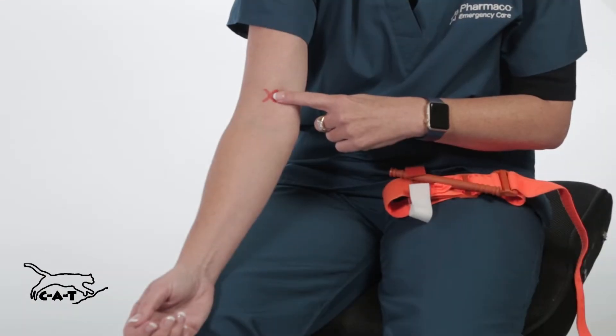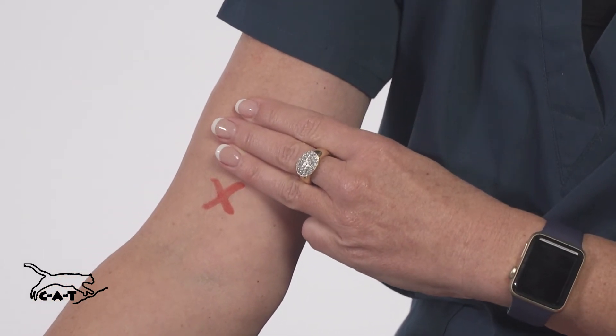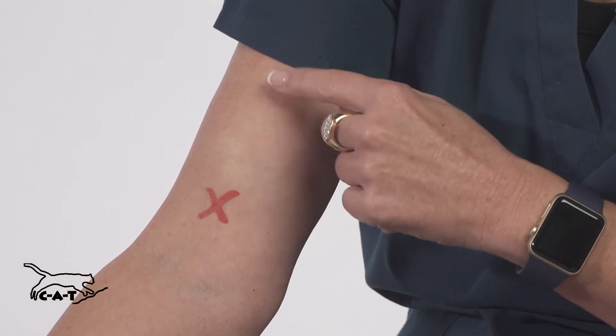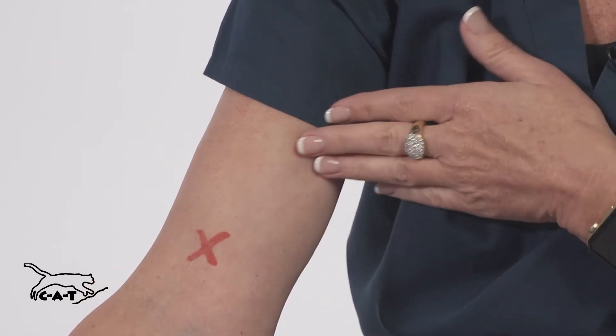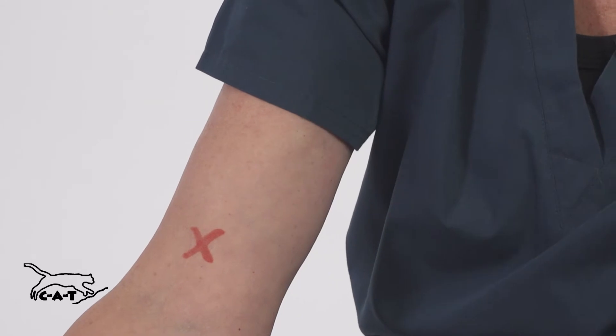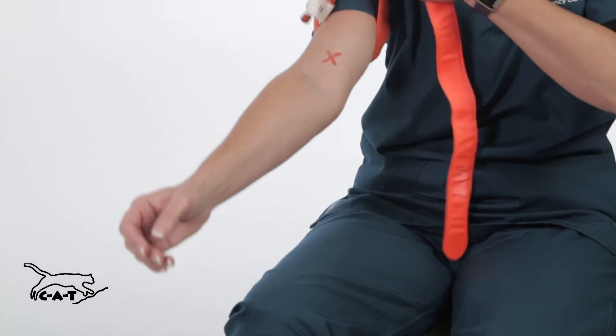Locate the wound. The CAT sits at least three finger widths above the wound. Ideally apply on bare skin, but you can apply over clothing, making sure no solid objects are in the way. Loosen the CAT and slide it over the injured arm.